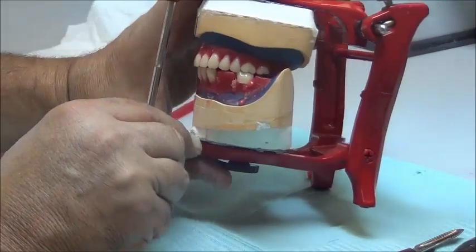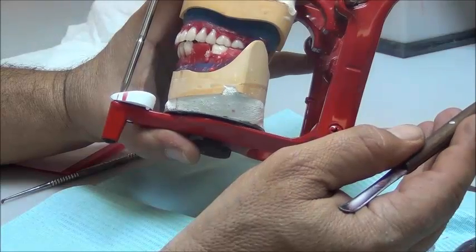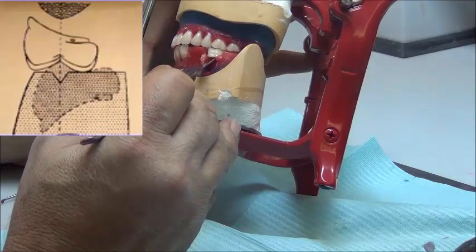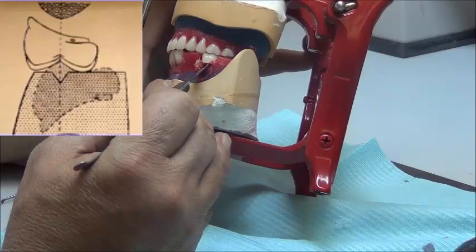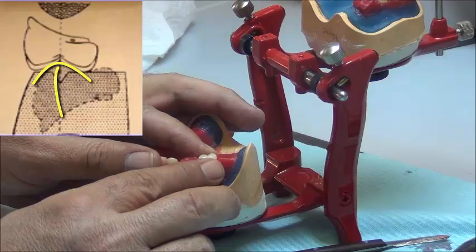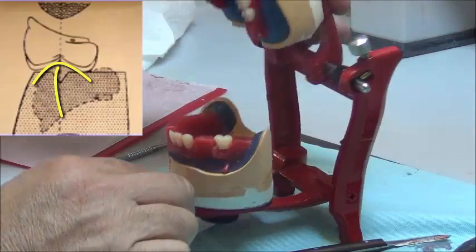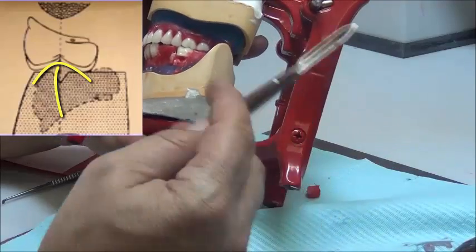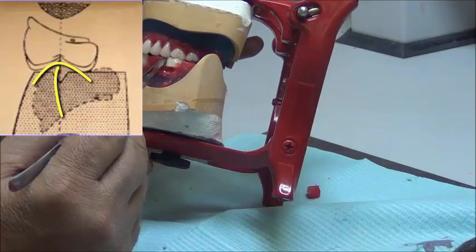And we just want to also point out that once you're working with the upper and then go to the lower, make sure your wax is totally cold. So what are we doing now? We are raising the tooth in location to increase the interdigitation between the cusps of the upper and the lower. Within its setting, you will find that on the mesial it's almost with the occlusal plane of the wax, but distally it's following the 6 going up. Why? Because we have the curve of Spee.